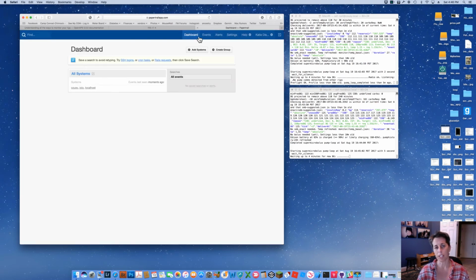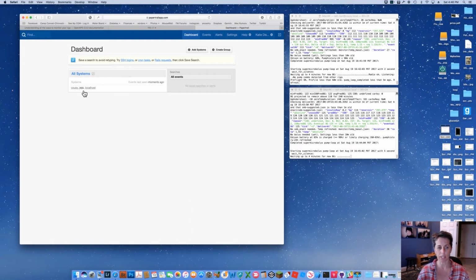And what the Papertrail looks like is if you go to the dashboard, you can see the names of the two rigs, Koozie and JoJo. But there's also a third part, and it's called localhost. And we're going to get back to that. But the important thing is all of the valuable information is going to be underneath the names of your rigs versus localhost.